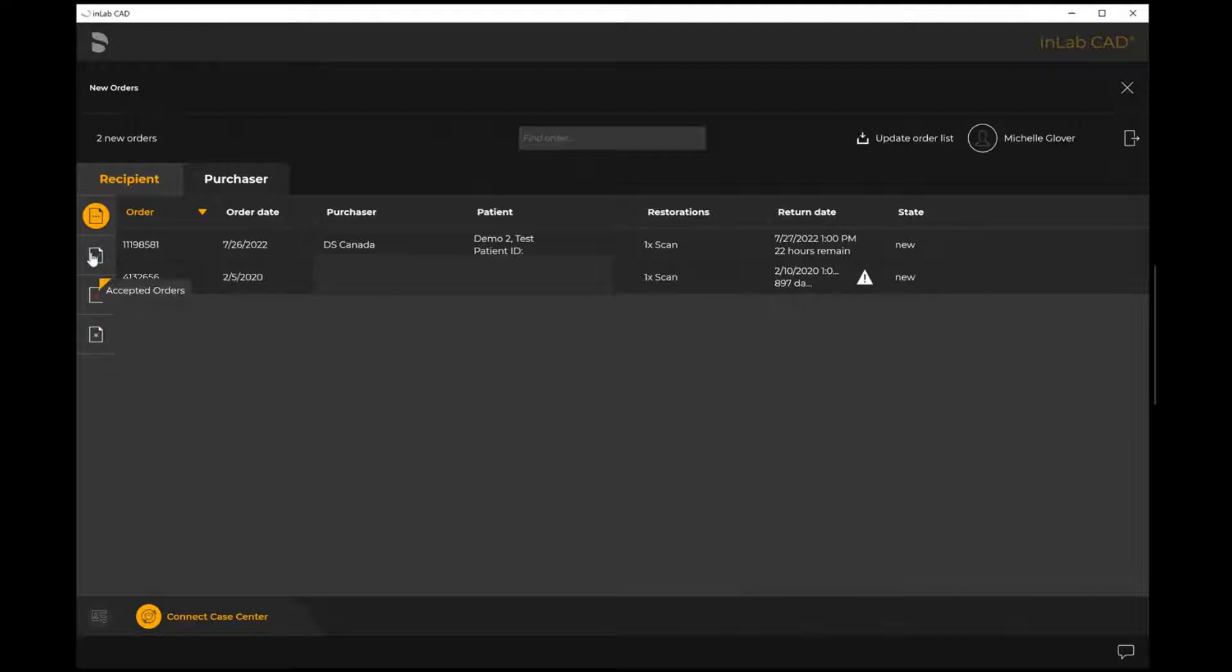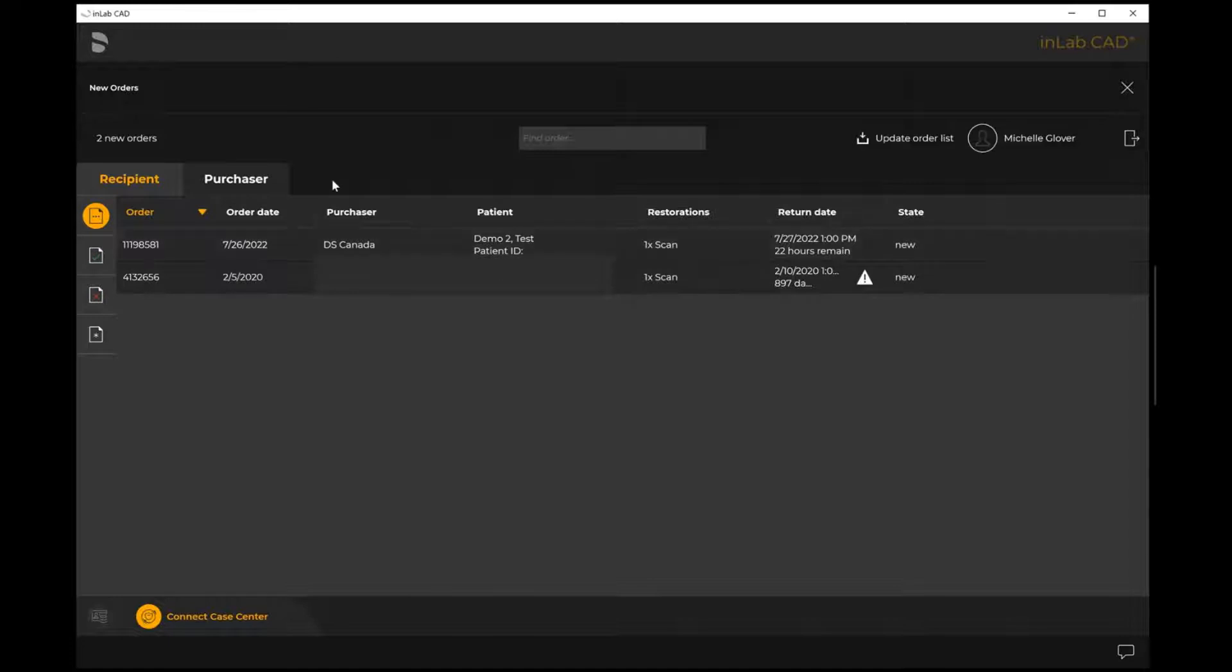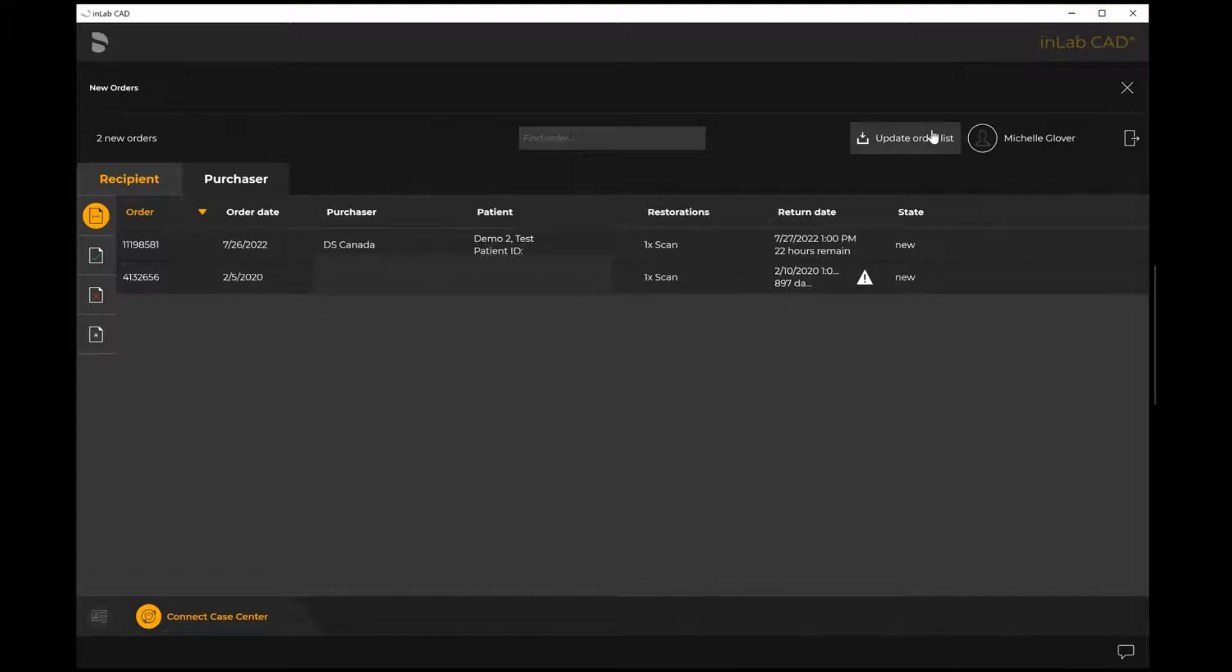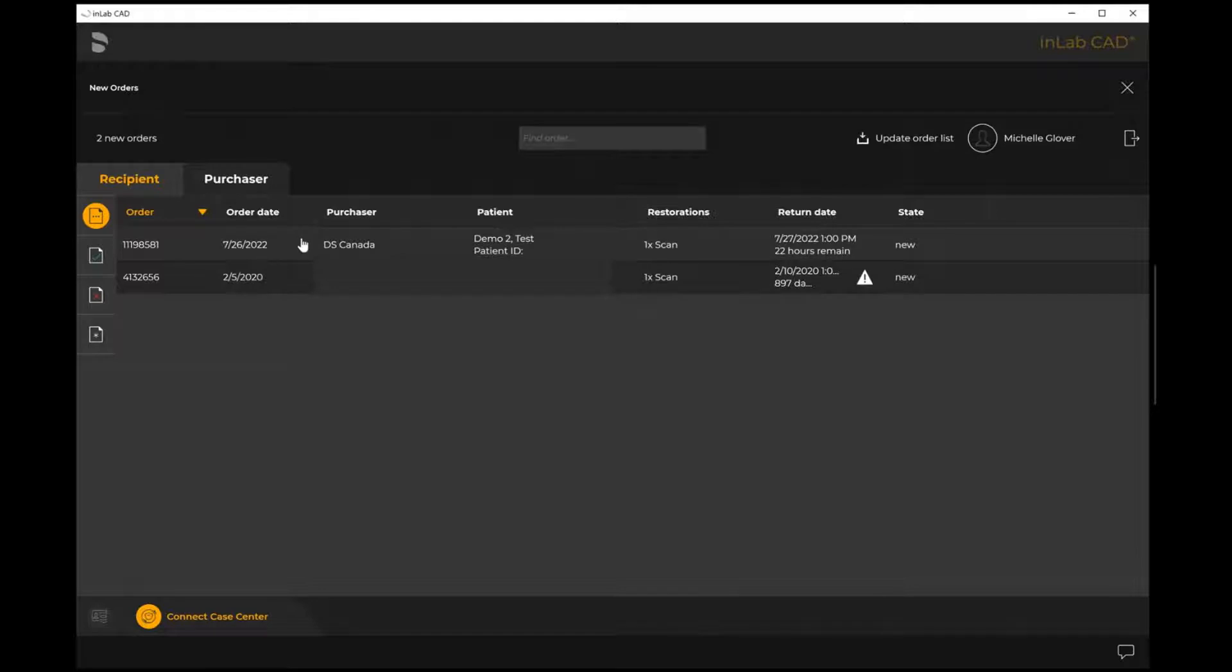If a doctor says hey I've sent you a case and it doesn't show up right away, you can always select update order lists. It'll just refresh your connect portal account page. At this point I'm going to highlight the case in question here.